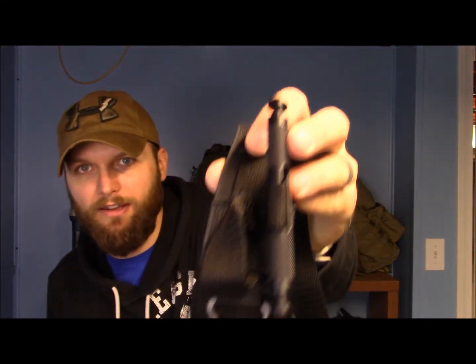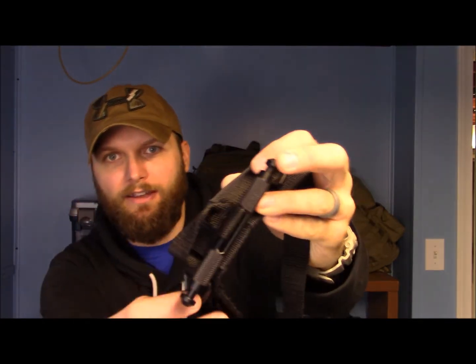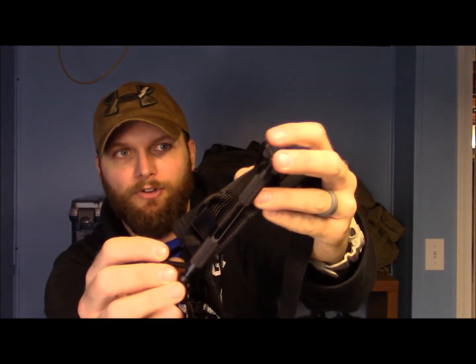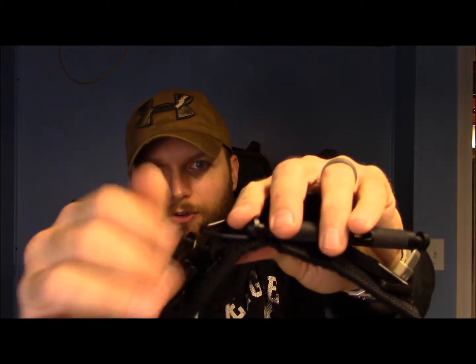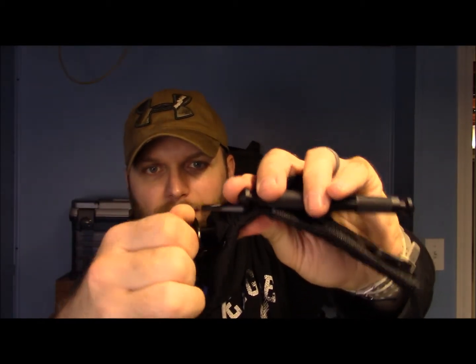As you can see, a SOF-T has that metal windlass there, and then it has these hooks that it hooks onto to stay in place. It has where the strap pulls through. It has this screw, and once you screw that down, that's tight. You can't move it either way.